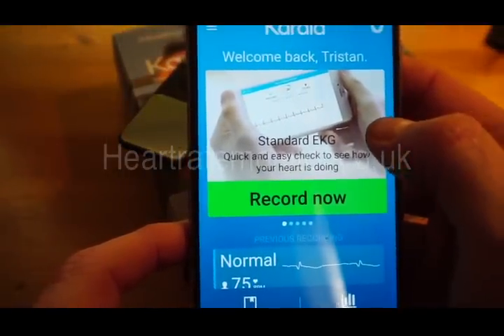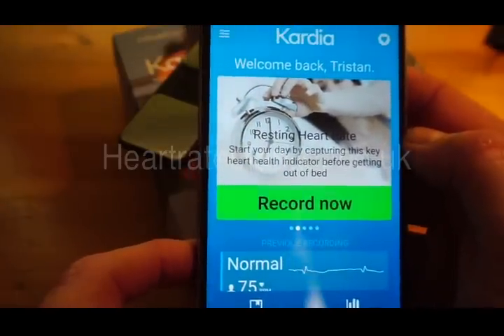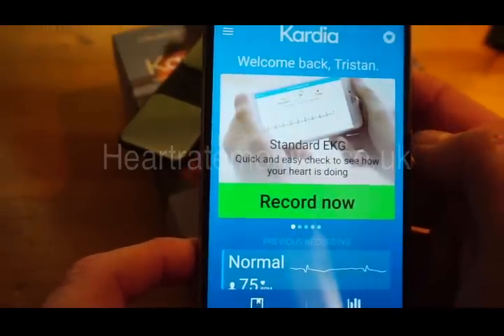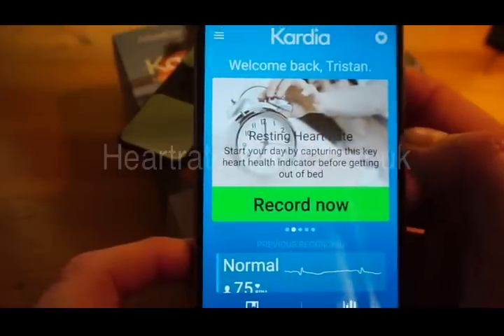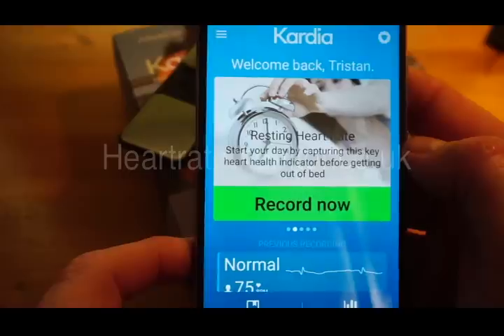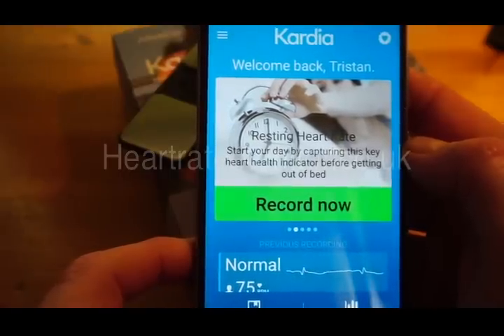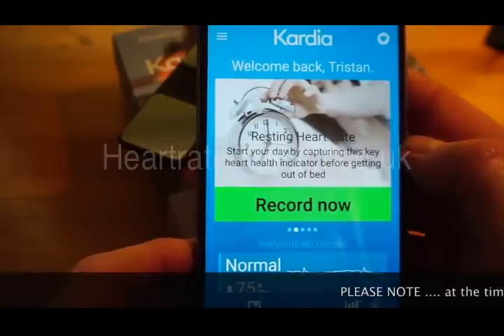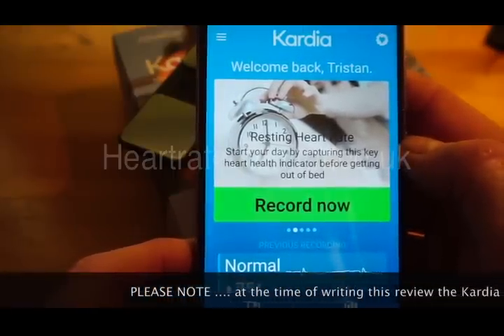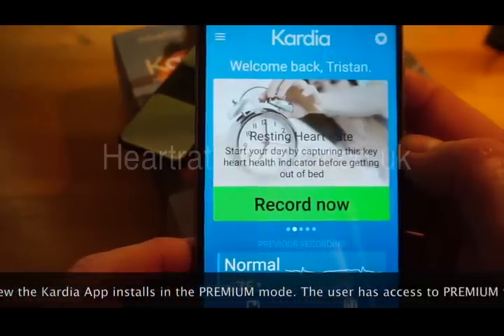There are a few features. We've got 'Record Now' — one for resting heart rate and one to do an ECG/EKG trace. The resting heart rate option is just a useful indicator of your general health and fitness. If you take your resting heart rate every morning before a cup of tea, coffee, or breakfast, it's a good indicator of how you're doing — if it's elevated, maybe you're tired, stressed, or overtrained if you're an athlete.